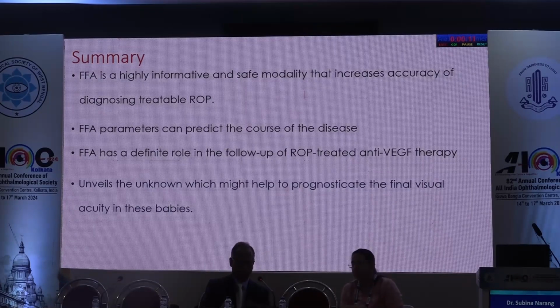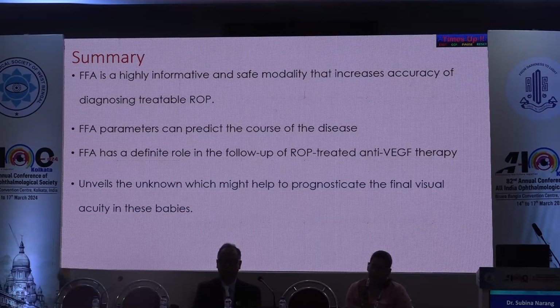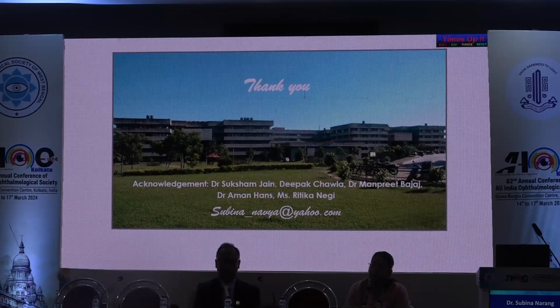So summarizing, FFA is a highly informative and safe modality that increases accuracy of diagnosing treatable ROP. FFA parameters can predict the course of the disease. FFA has a definitive role to follow up ROP babies who are treated with anti-VEGF therapy, so that you could treat them whenever recurrence is there or treat the peripheral avascular retina. It unveils the unknown, which might help to prognosticate the final visual acuity in these babies. Thank you.